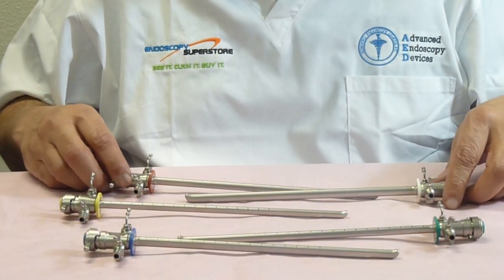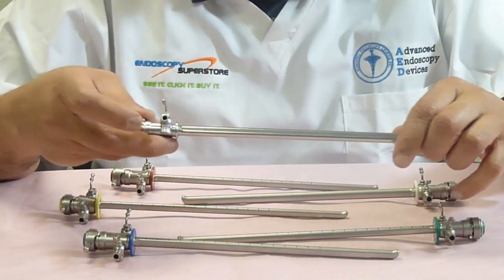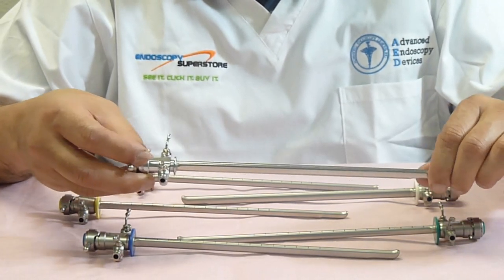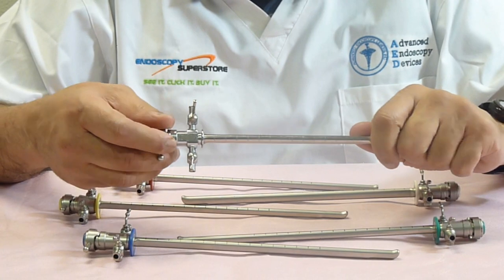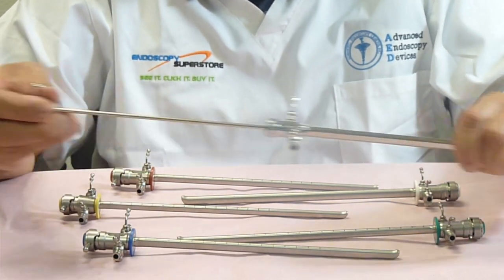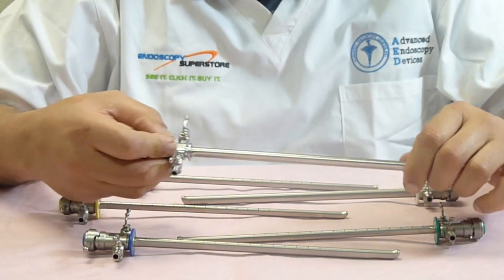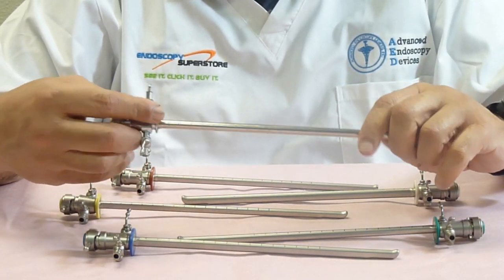Now many of you may say you've seen these sheaths before, and they are very similar to another brand — which I will not name — but our sheaths are identical to the specifications of that other brand, and they will be completely interchangeable. They come out and lock in using the same bayonet mount style, so you'll be able to interchange our sheaths with the competitor's sheaths.